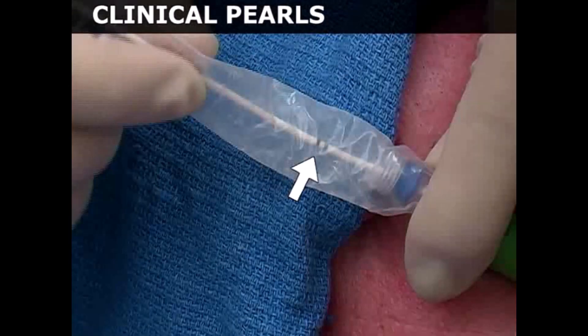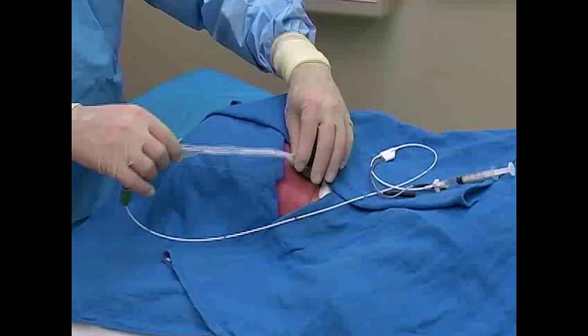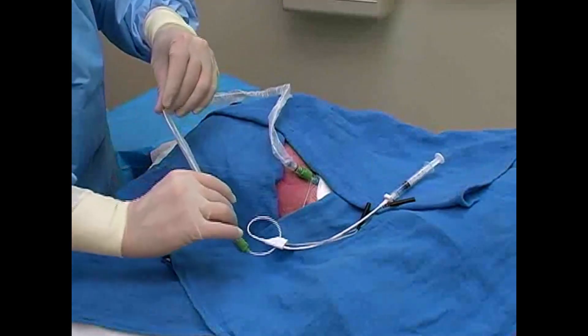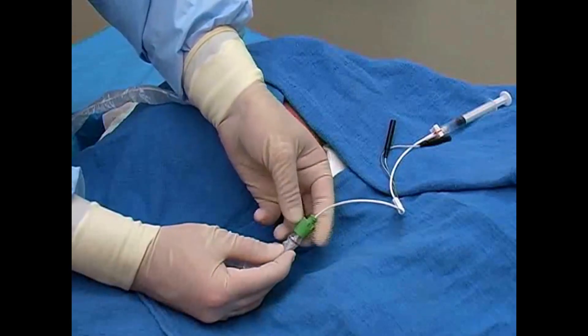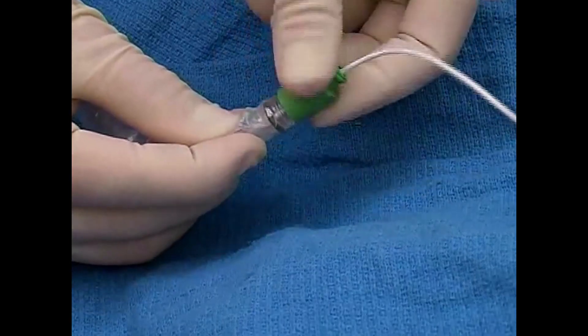At this step of the procedure, the 20 centimeter mark should be positioned close to the region where the sheath introducer enters the skin. Next, extend the sterile sleeve over the catheter. The sleeve maintains a sterile environment around the catheter, allowing it to be repositioned without the risk of contamination. If your sleeve has a closable valve, securely tighten it around the catheter by twisting clockwise.